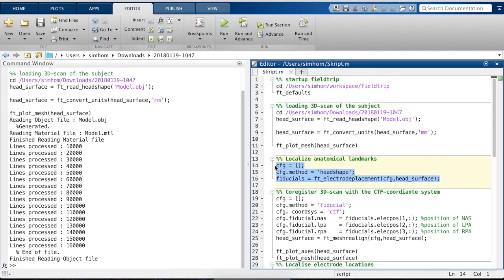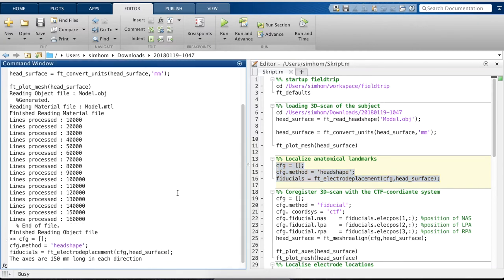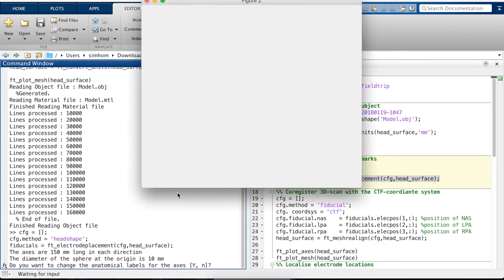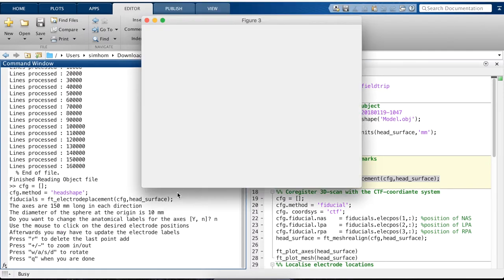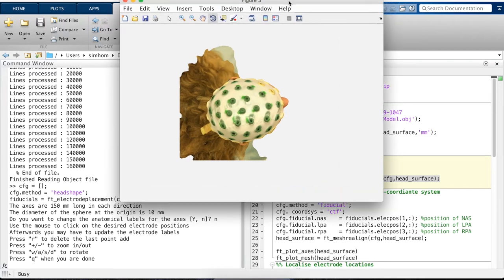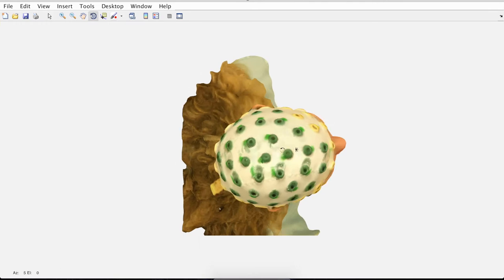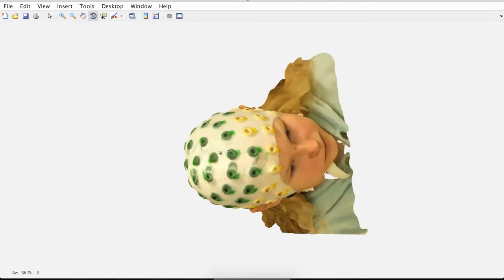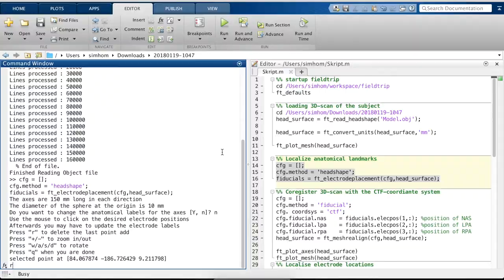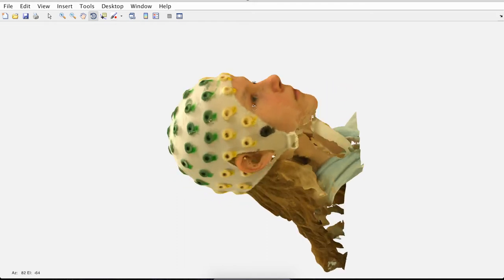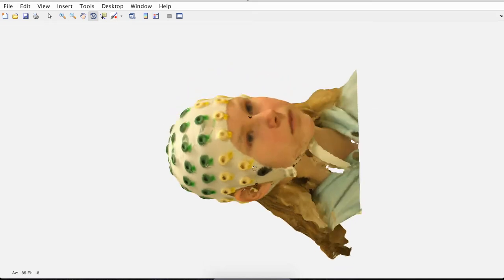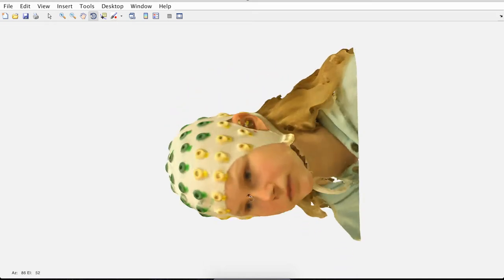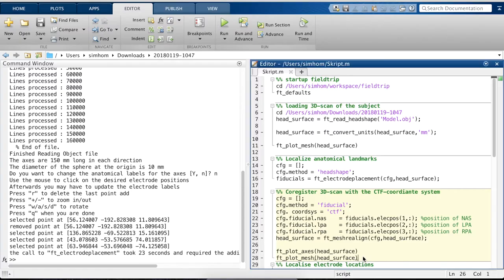After that, we mark the fiducials on the subject. Therefore, we have to take again the rotate tool. Make it bigger so we can better see the subject's dataset. There we press it. We have to press R to remove this electrode. Then we click on the nose. Hold the click. And then we can rotate it to see the other fiducials. Then we click again. Hold it. Rotate to the other side of the head. Click again on the fiducials. After this, we press Q to finalize it.